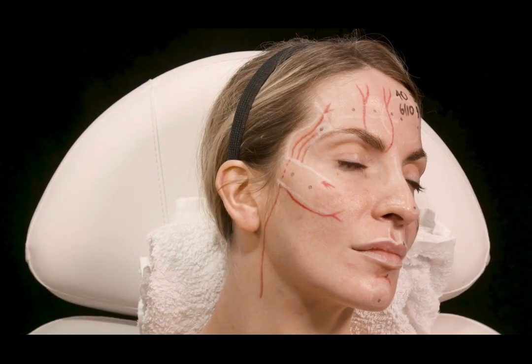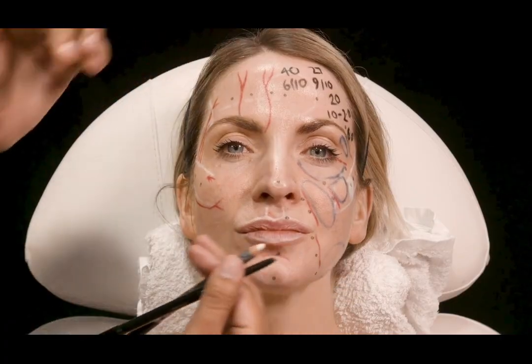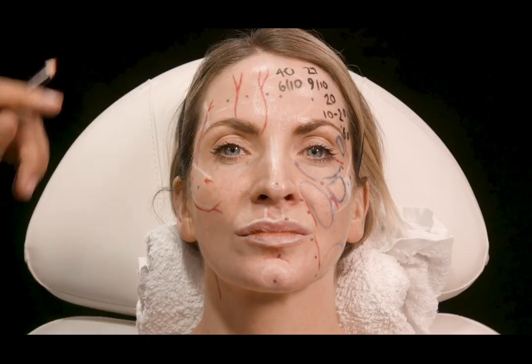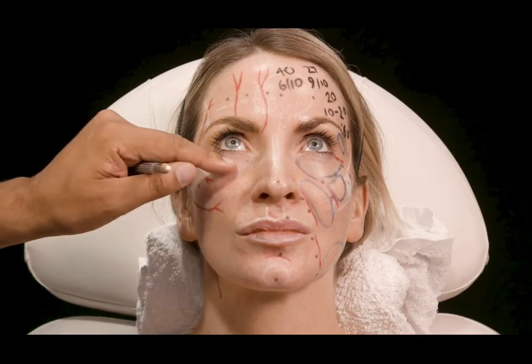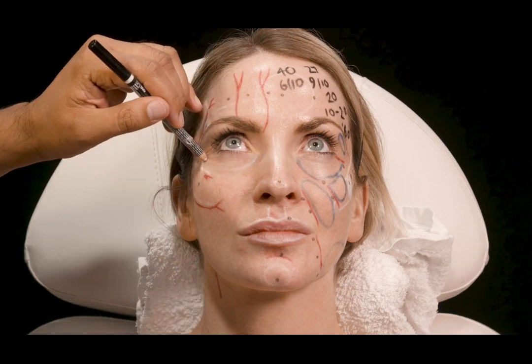When we're dealing with the medial cheek, I think we talked about the midpupillary line. I mean, it's really the medial limbic line, which is the dangerous territory. Eyes up, please. So I'm going to mark out, first of all, the infraorbital rim.